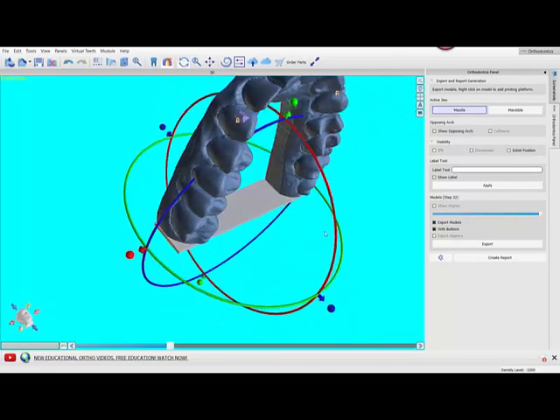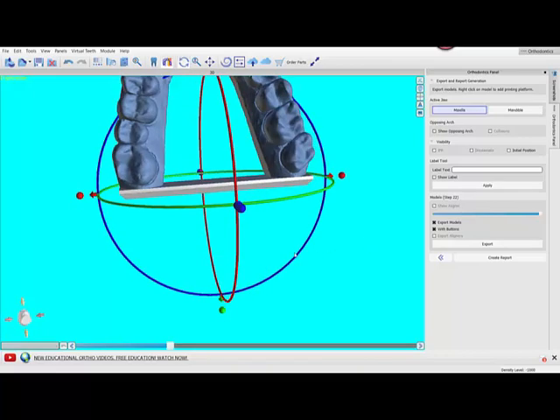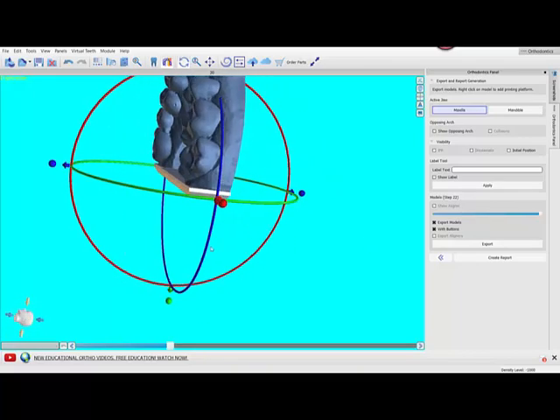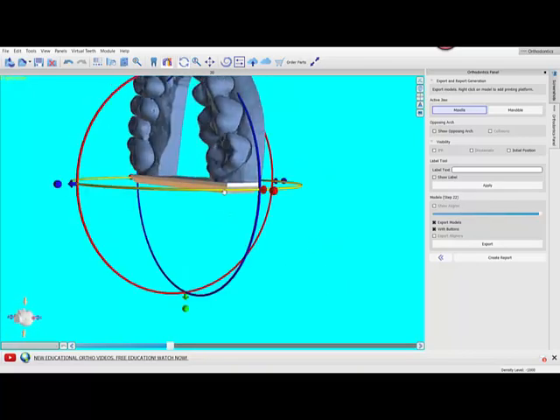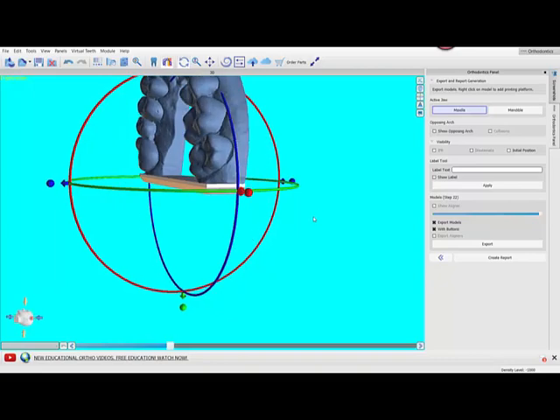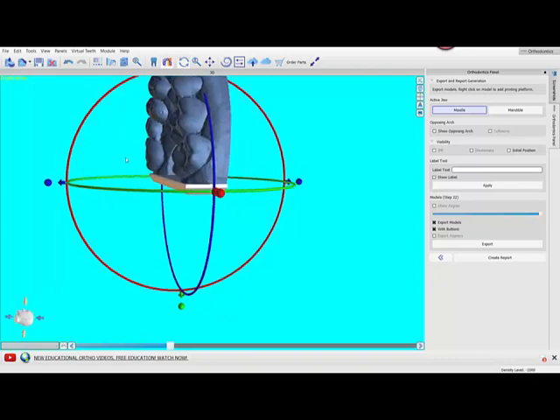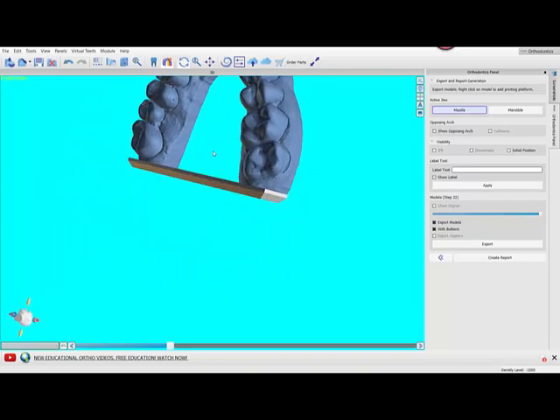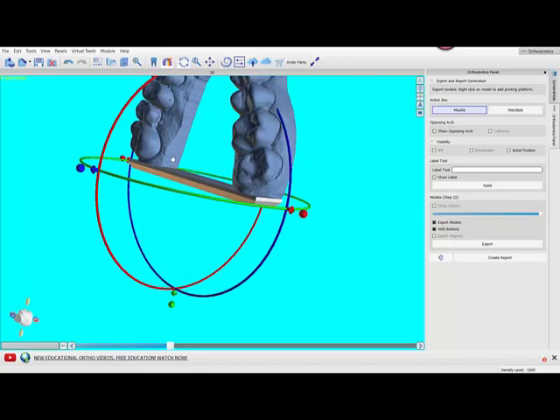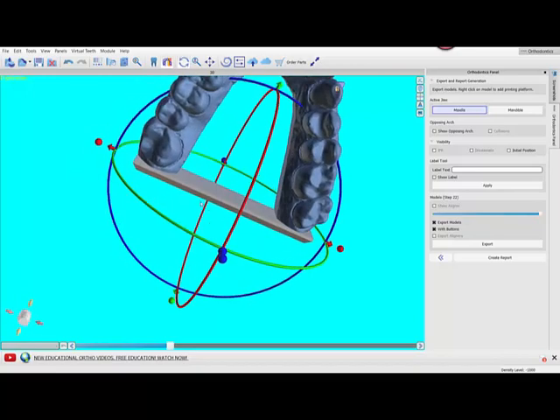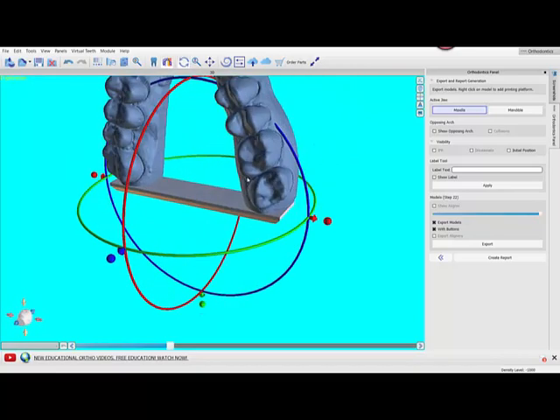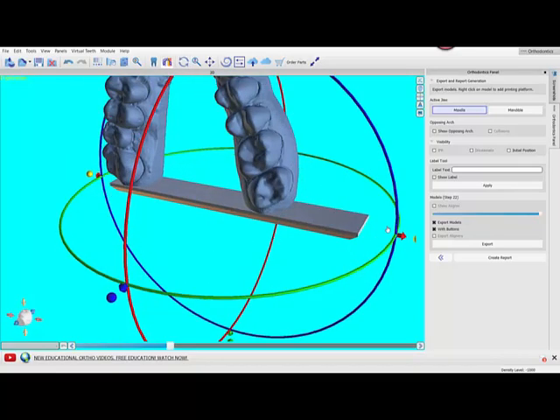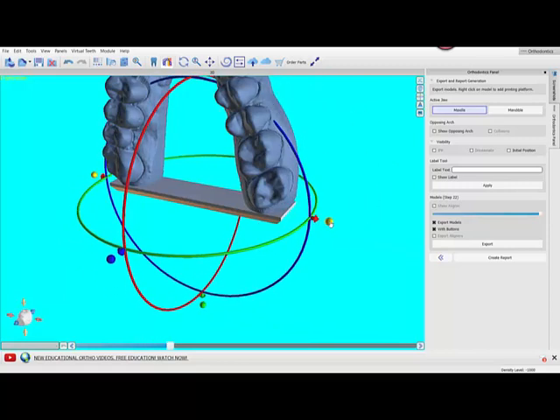So that's it. Just a quick recap: we have embedded the heels, we have tipped it according to any teeth limitations for vertical printing, and then we have scaled it so as not to waste resin. But also if it's too big that makes it harder fitting more models.